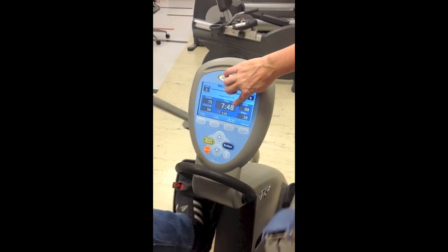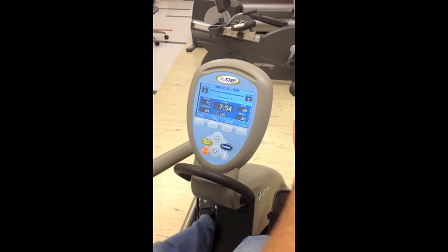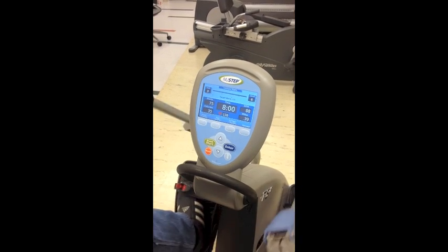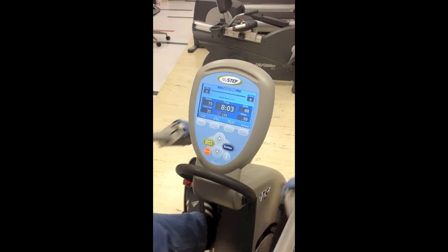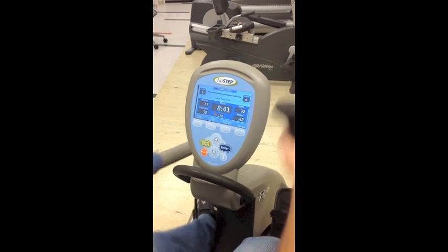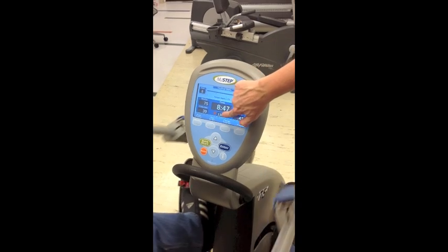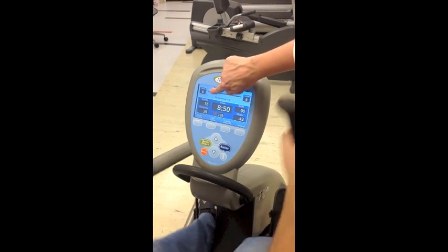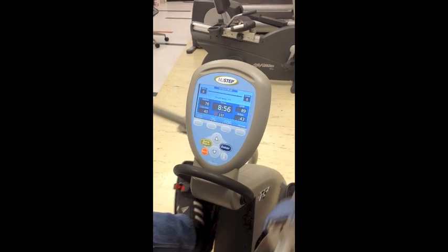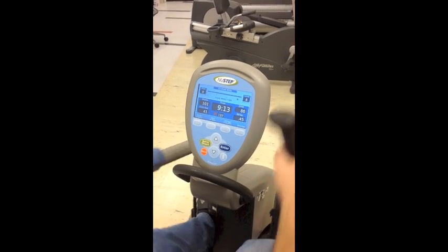Right before minute eight, looking at the heart rate at 75 watts, we see what their heart rate is and record that on our data sheet. As we approach minute nine, we check that heart rate again, and if it is within five beats of the prior minute, they get to move to the next stage; otherwise they need to repeat it. This individual is within the allotted range, so we are going to increase the workload and go to 100 watts.